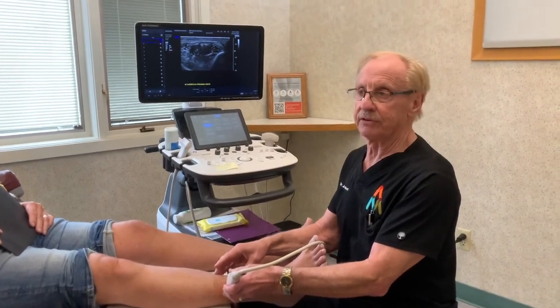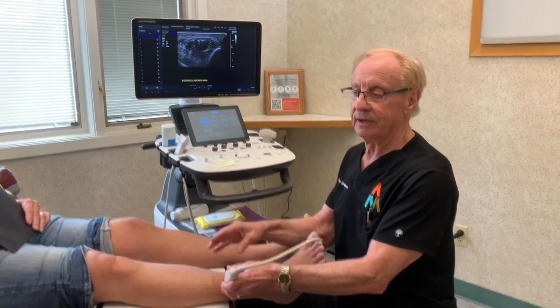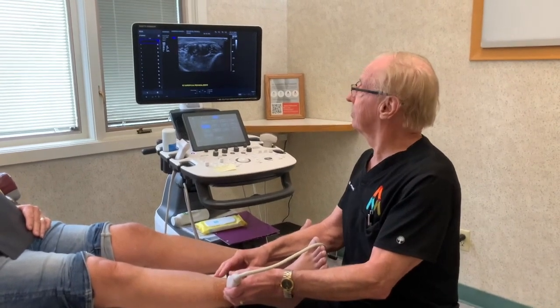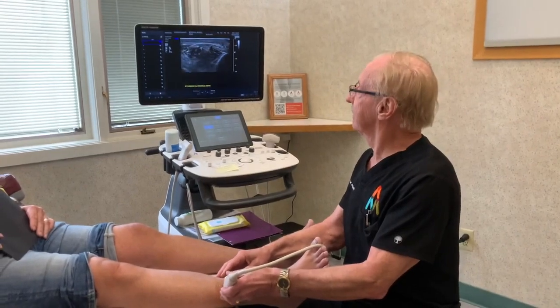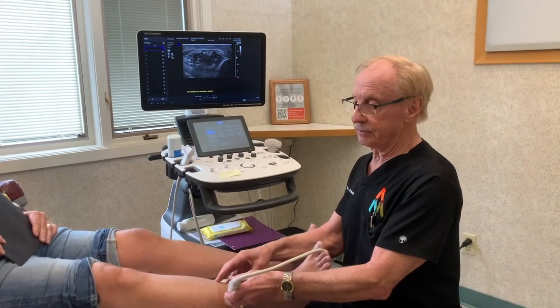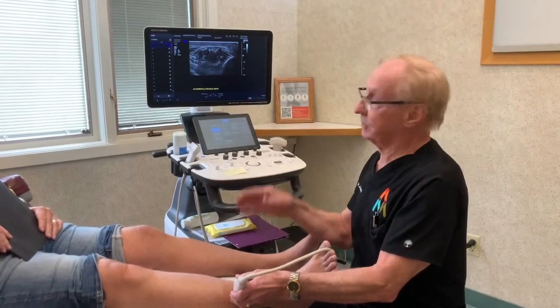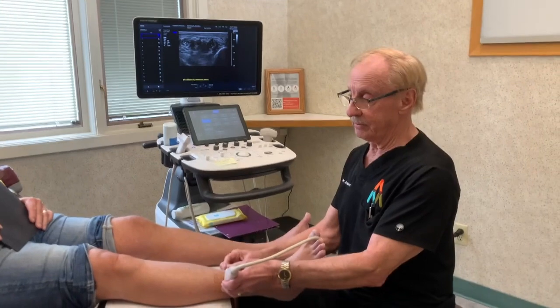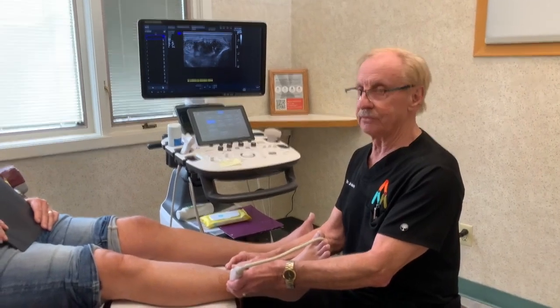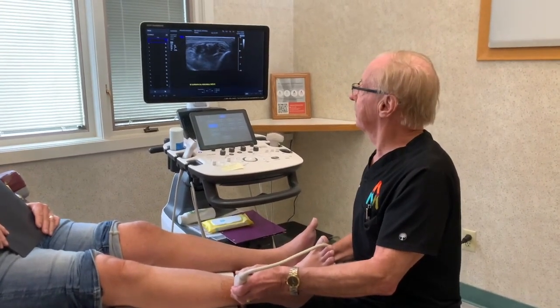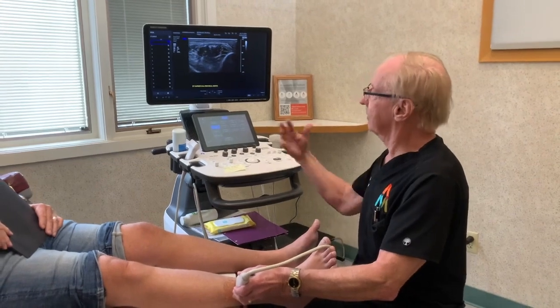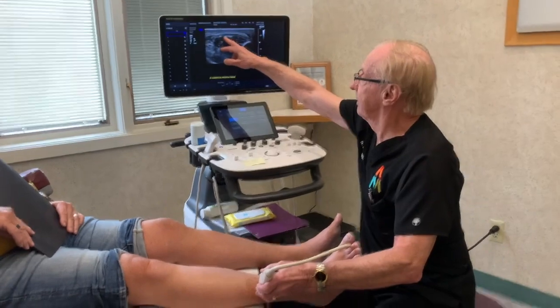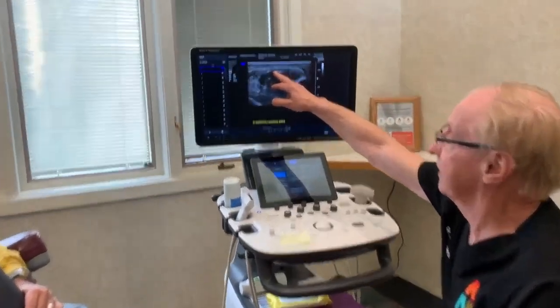What I want to show you is this nerve tunnel — it's called the superficial peroneal nerve tunnel — and it's one of the primary tunnels I think is implicated in creating restless legs. We oftentimes use an ultrasound machine to show compression, and it also helps me plan surgery so I know where to make my incision. I can usually make the incision smaller by pre-planning with ultrasound.